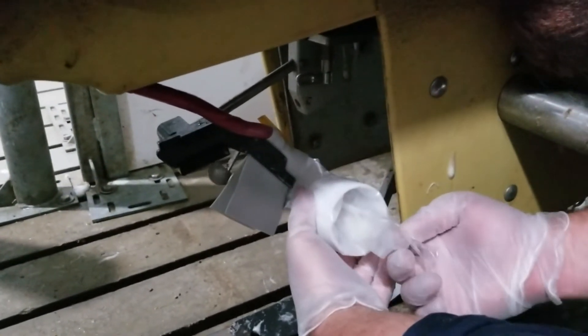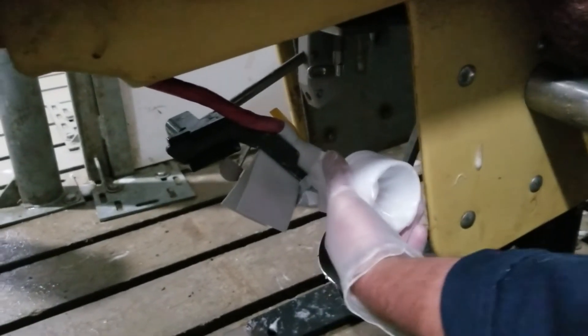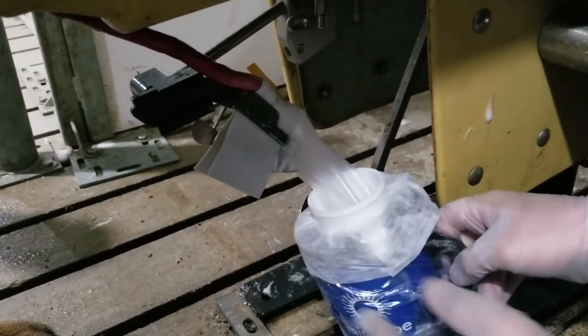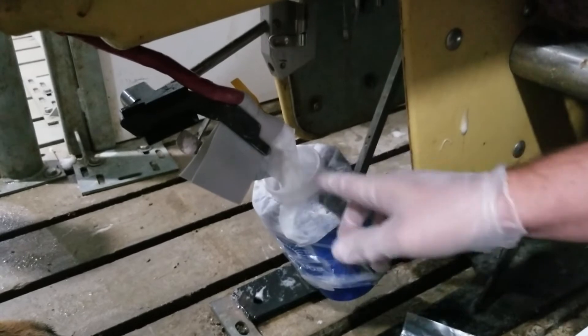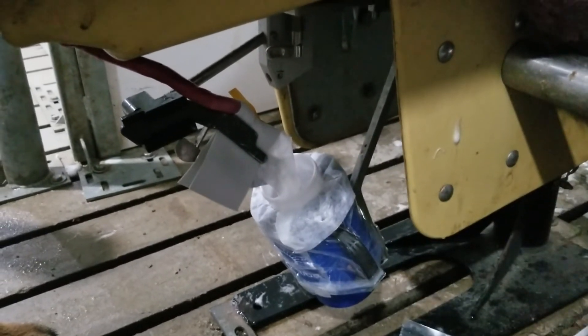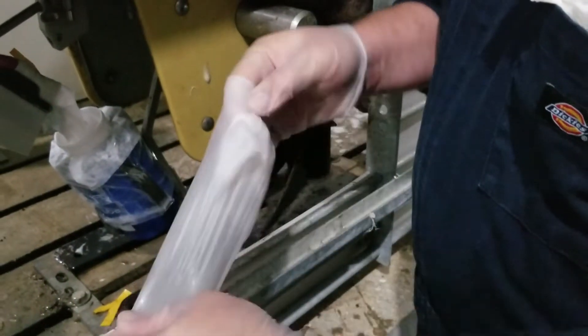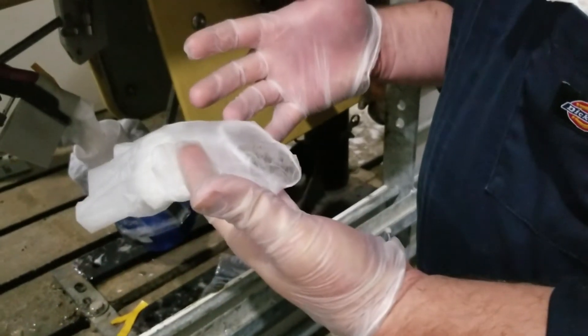So during that process he threw his pre-ejaculate in the inner bag. So I'm going to rip that out, grab my cup, place the collar inside the cup and then the cup inside the cup holder. And now he's started to ejaculate. I'm going to take these outer gloves off so that I have two new clean gloves to do the rest of the process when he's done.